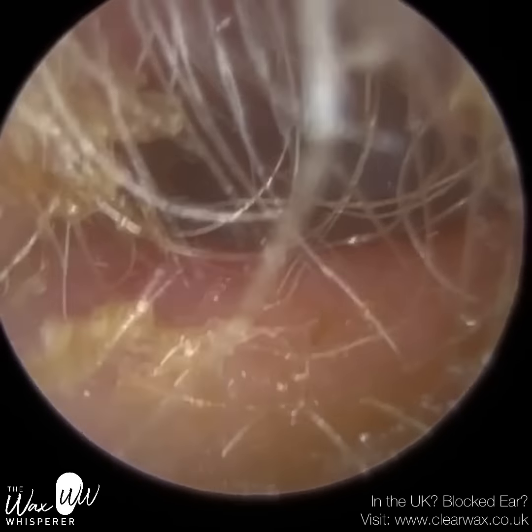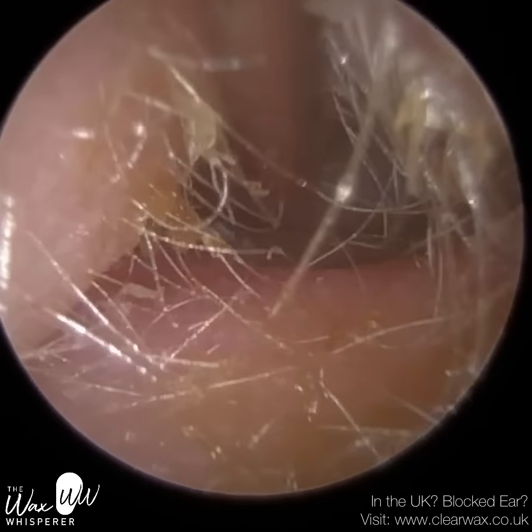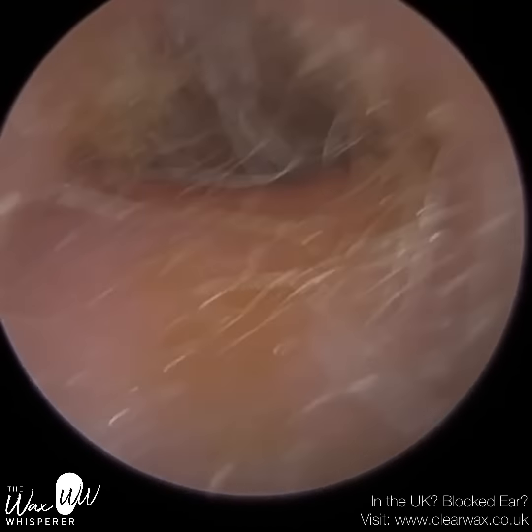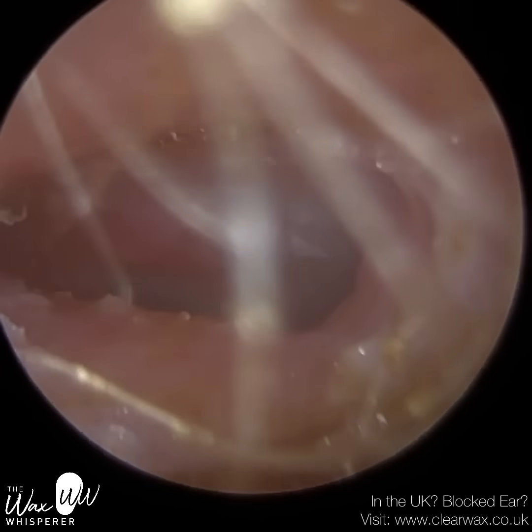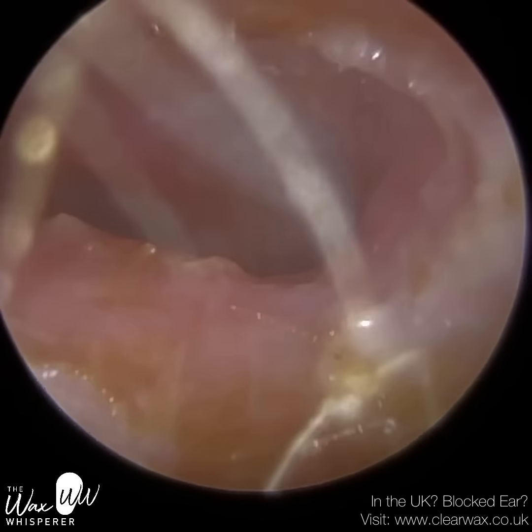So this is probably the more complex one out of the 2, purely because we have to work on the eardrum. Whenever we work on the eardrum, it becomes a bit more complex because that's the most delicate part of the ear, really. If you perforate that ear, that's the last thing anyone wants to do, so we're going to be extra cautious.